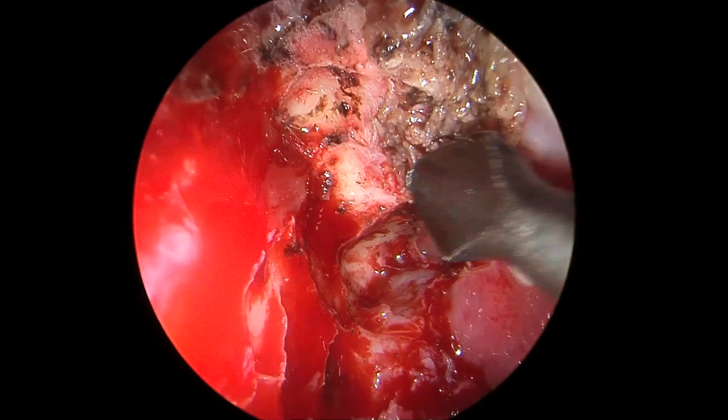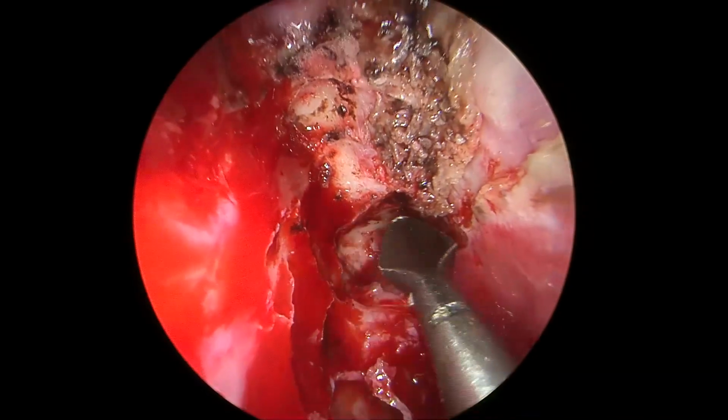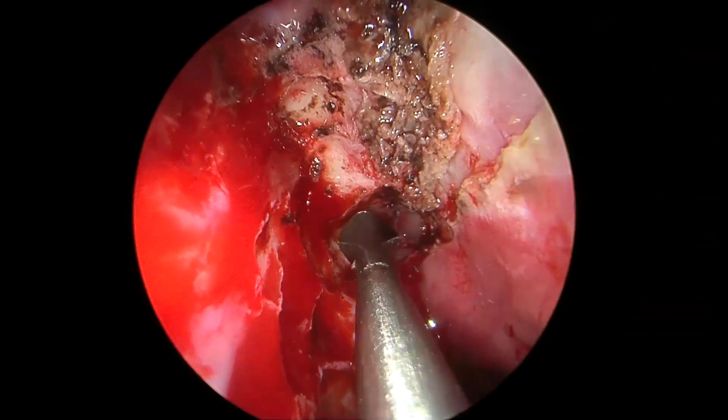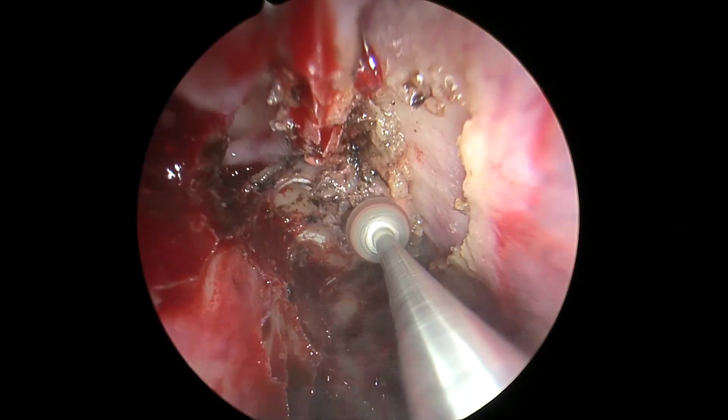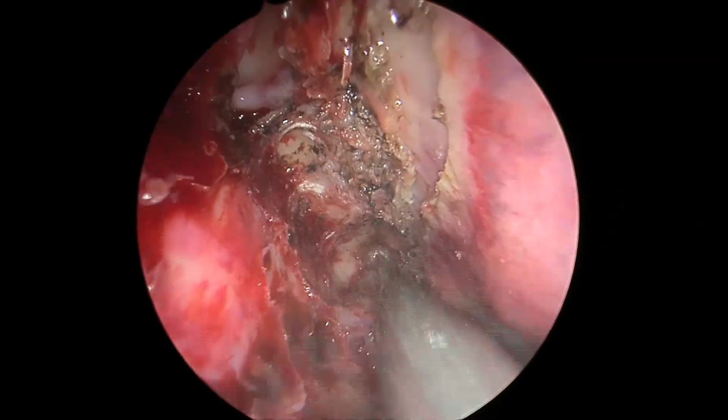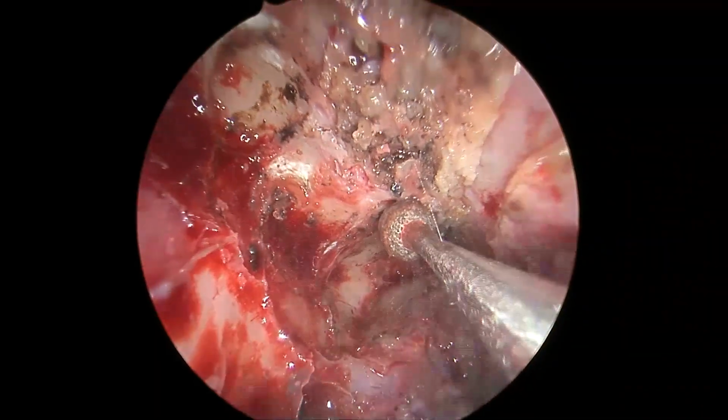The fat will not be kept just lying here, mind you. The fat has to be inserted with more of it inside than outside, so it is a sort of tight seal. Over that, we would like to keep a fascia, because we want to be very sure that everything is tightly set and not just loosely lying here.